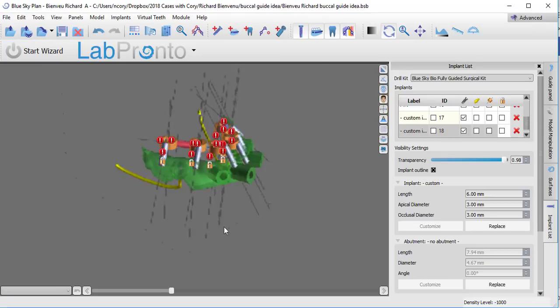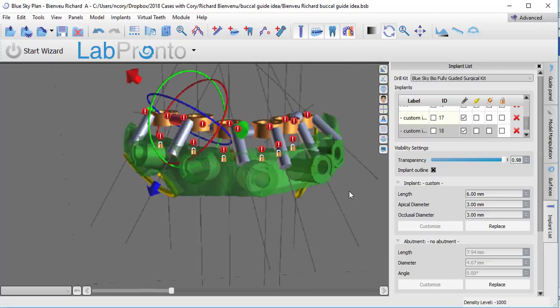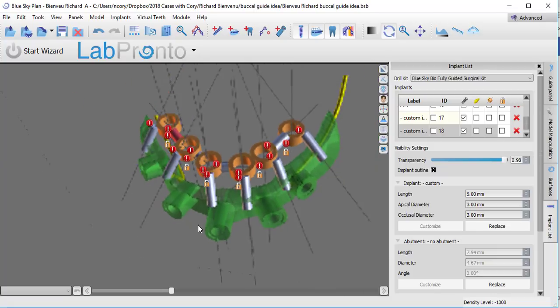Okay, so now we have everything connected. We have each guide tube connected to one another and down to this portion. Now the nice thing if you do metal is that you could probably just connect the implants together and then one on each end here, and that's really it. I mean, there's not much need to have any more strength because metal's so strong. But in resin, this is a good option here.